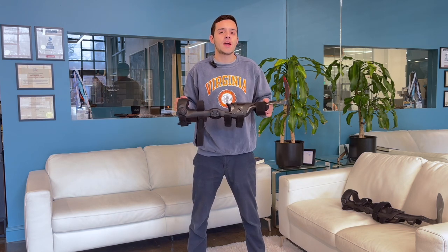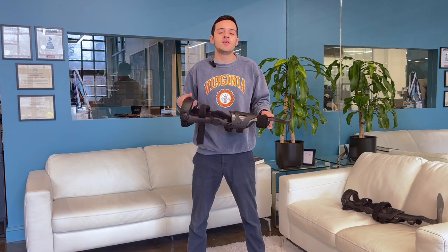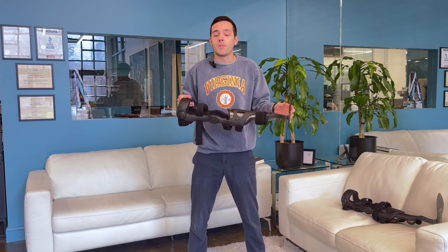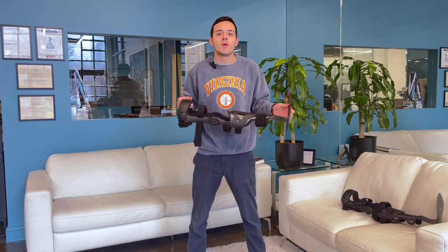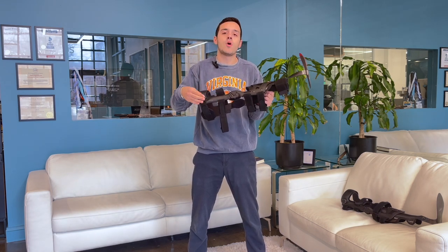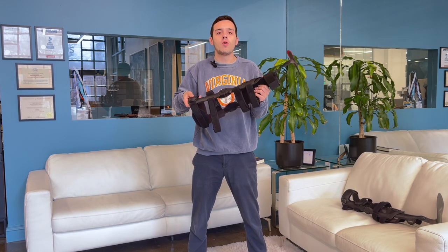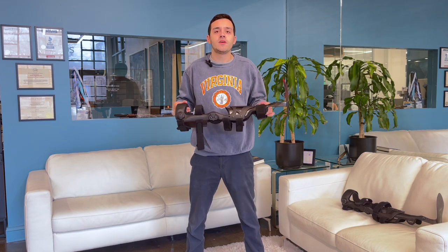I personally suffer from Charcot-Marie Tooth Disorder, CMT, and I actually created the very first prototype of this device to help me deal with my drop foot, which the AFO portion helps with amazingly, but also in combination with quadricep weakness. So I'm able to wear this Hercules CAFO to support my ankle while also having a dynamic quadricep support method through the swing assist control of the Hercules CAFO.